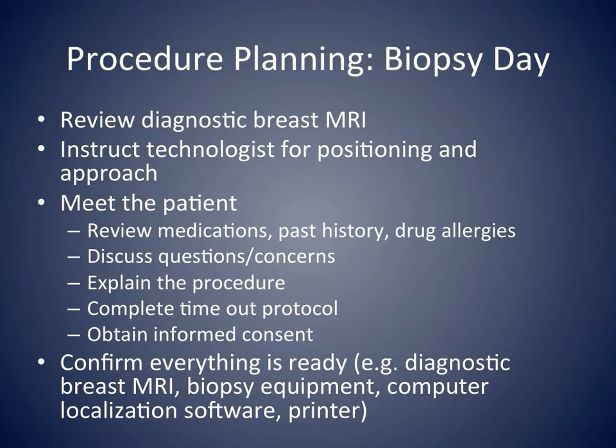Before performing the biopsy, we do the timeout, obtain the informed consent, and verify that the equipment is ready.